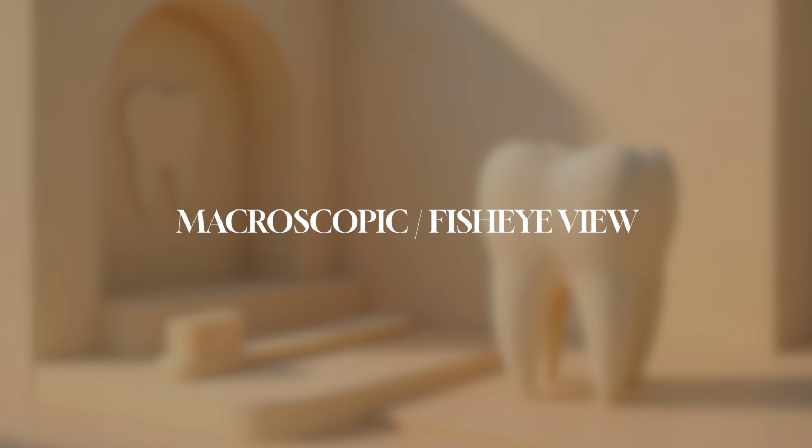Now, the techniques that we described till now are usually enough to help you locate calcified canals in the majority of cases, but there are some cases which do not follow a prescribed norm. So let me show you a case or two where we can employ this macroscopic perspective, which means we are involved deep in the canal under magnification, looking for the canal.